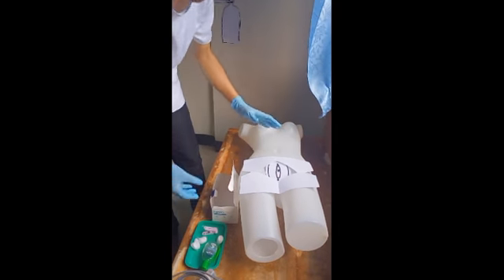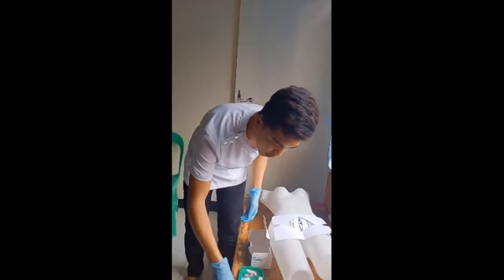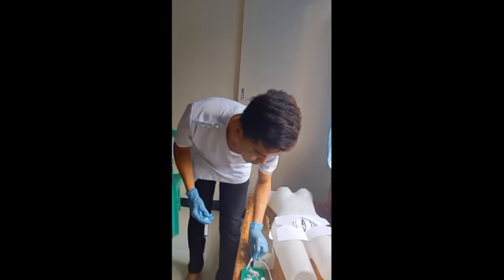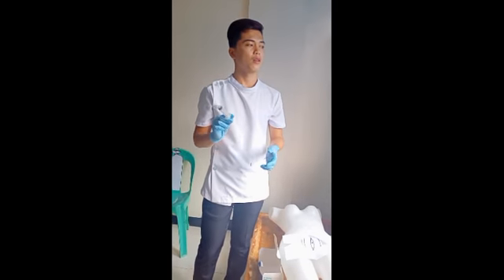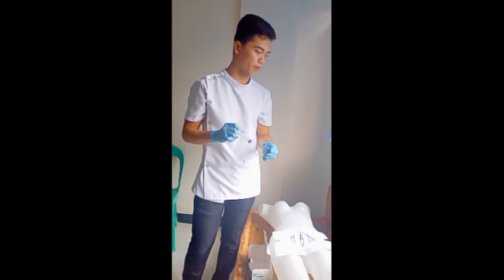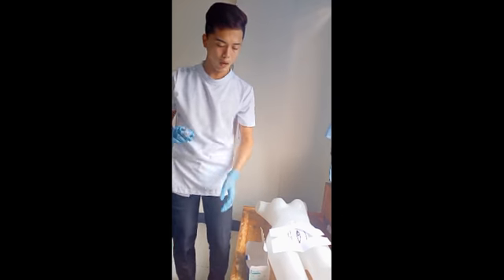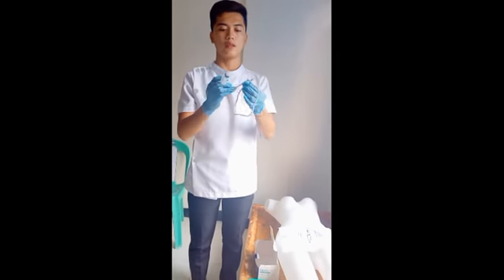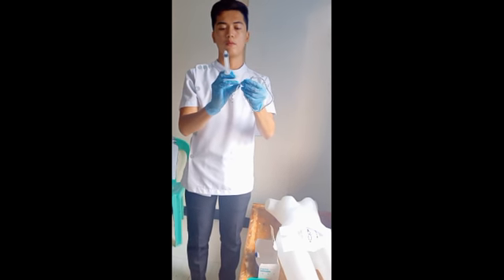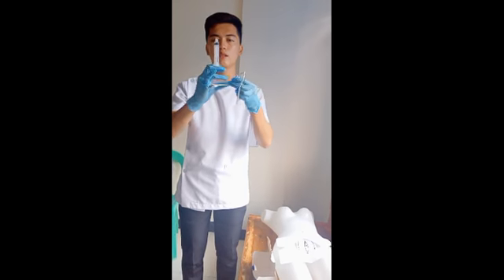So let's assume I'm done. The next is I'm going to check if the urinary catheter balloon, just like a circle in this part, okay?